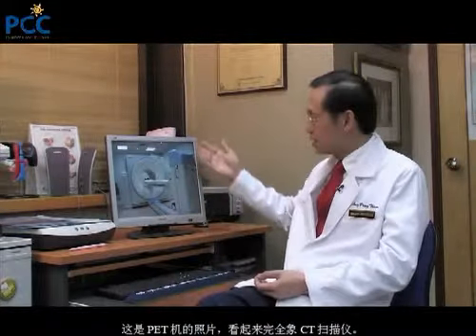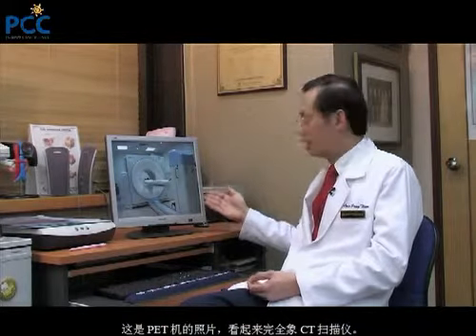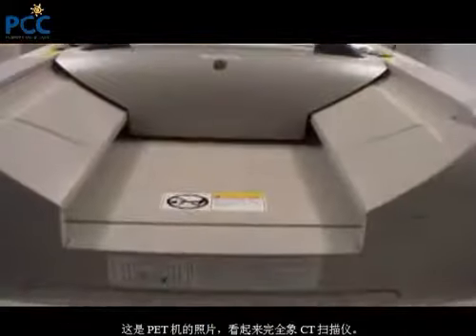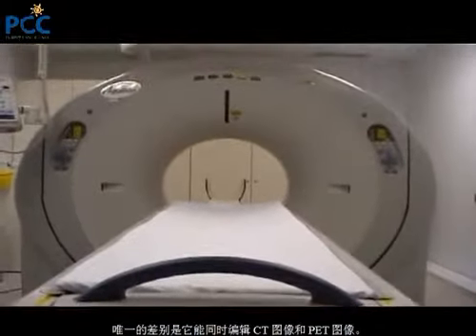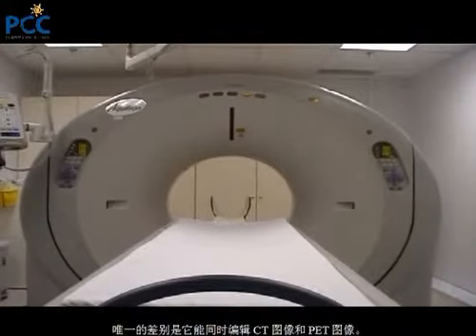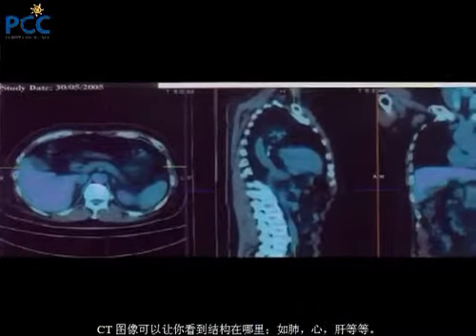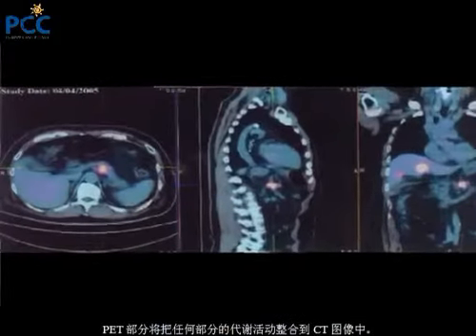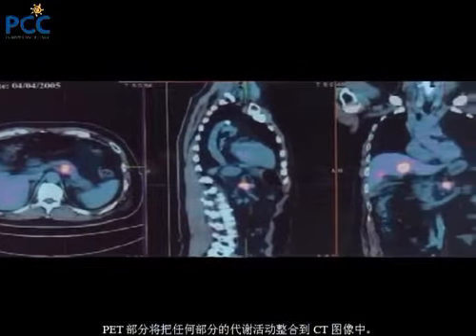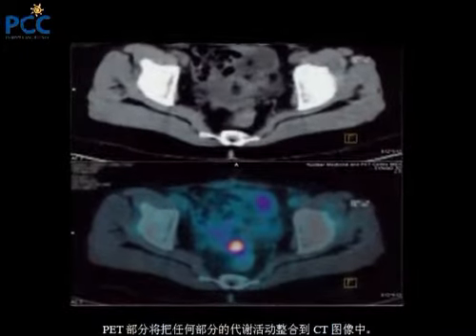This is a picture of a PET machine. It looks exactly like a CT scan machine. The only difference is that it compiles both the CT images as well as the PET images. And the CT images will show you the structures where they are, the lung, the heart, the liver, and so on, while the PET part of it will incorporate into the CT images any areas of metabolic activity.